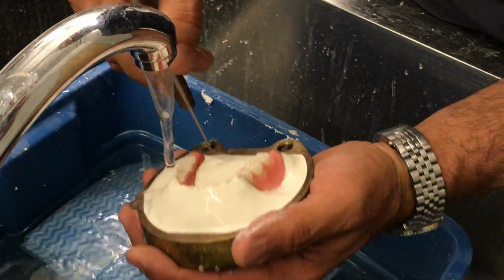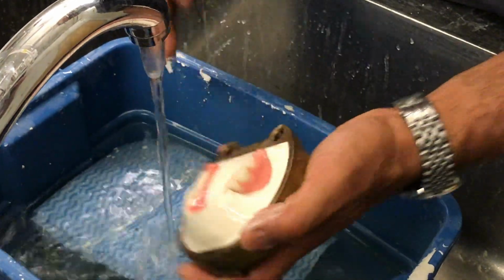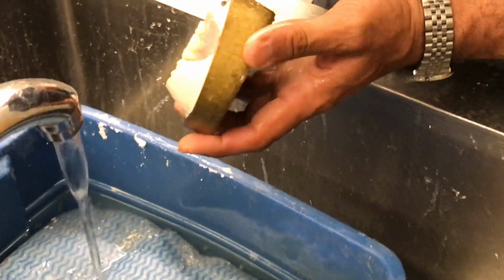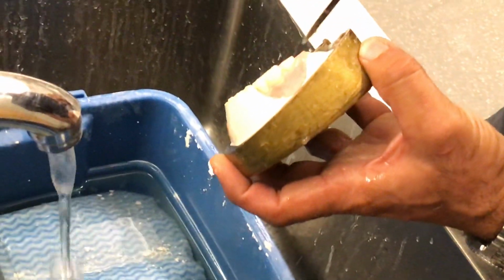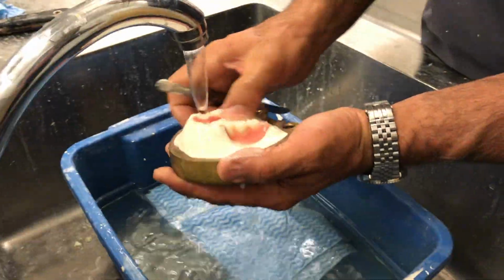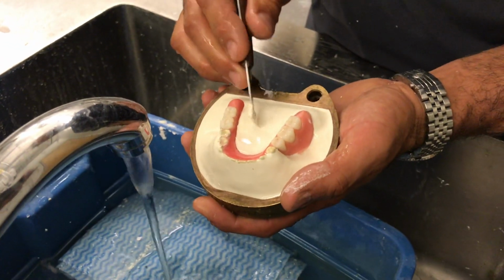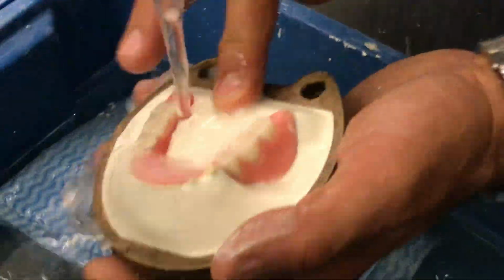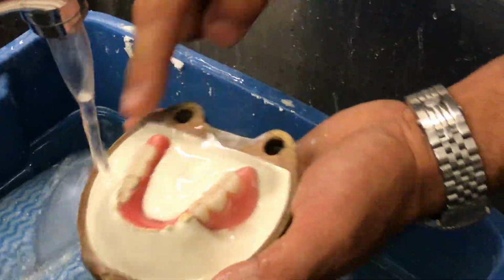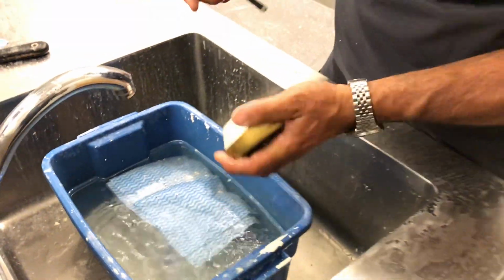Clean off the little holes here and make everything as smooth as possible. Notice that I used the lower flask designated for the lower model. You can see it has this angle on it in relation to the base to accommodate the height of the retromolar pads. But if you happen to reverse them by mistake, it's not the end of the world, it'll still work. Just trying to get rid of this little bubble in here. That's good. Okay, that seems to be okay.